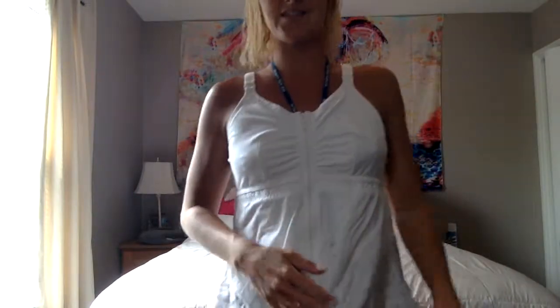And then they also gave me, and this is actually for showering, this nice little white vest that I'm wearing here. I opted to not wear the vest, and my reason being is that it was very tight when I put this vest on directly, 2 days after having surgery. It was just really tight here. And how this vest is made to hold the drains, let me see if I can move back here. Okay. So how this vest is made is it holds the drains here.